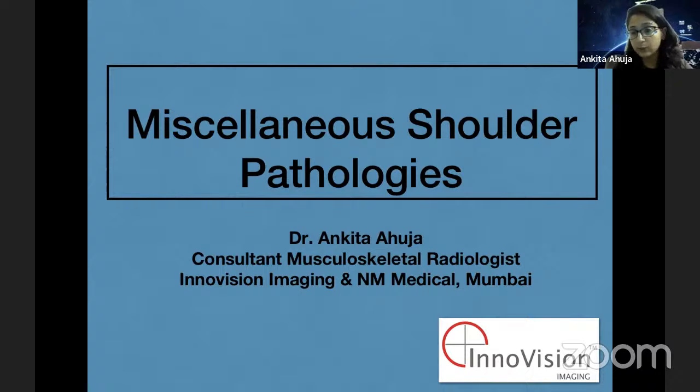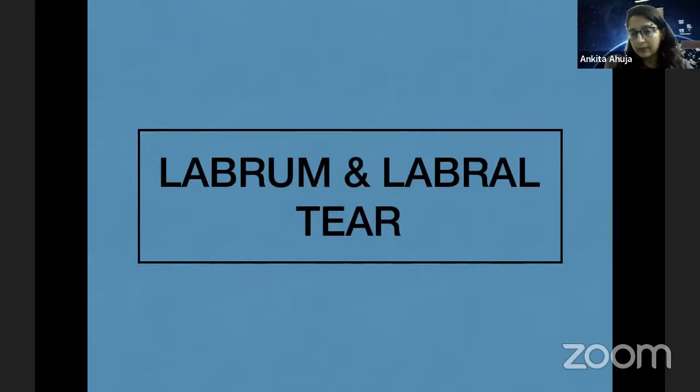And as we have been going through this shoulder series, today I will be trying to cover some of the miscellaneous topics which might have been covered in bits and pieces here and there. But let's go ahead and see. And if at the end there are any other topics remaining which you are interested in, you can just post that on the chat group and we'll try to cover it in the next session, which will be a case-based session. So let's start with labrum and labral tear.